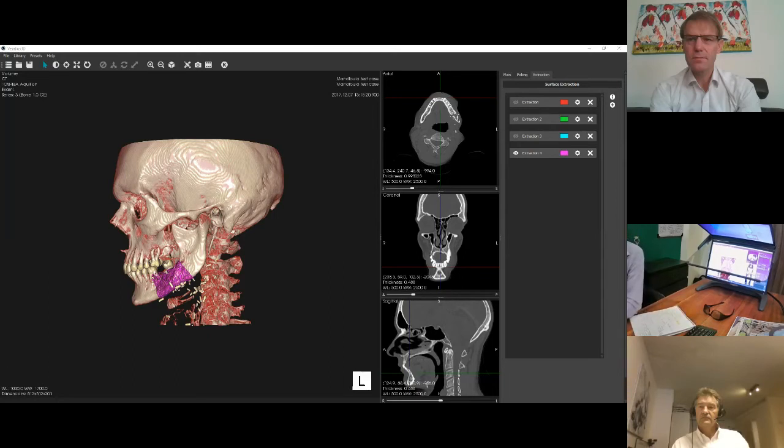And the next question is, can we use CBCT data? CBCT data, I have that. That's a dental scan, if I'm correct.